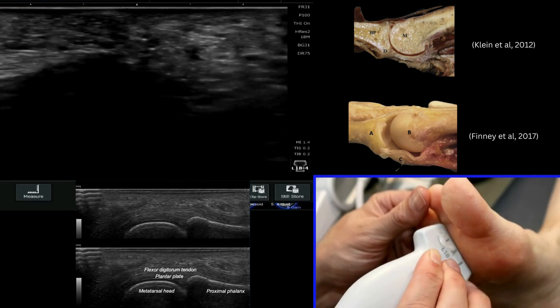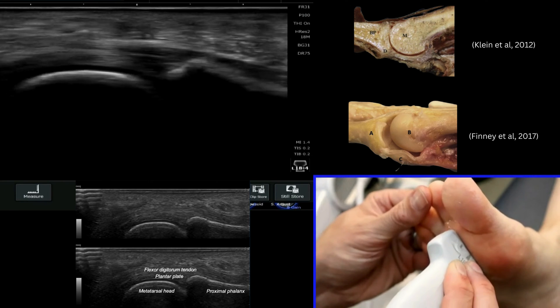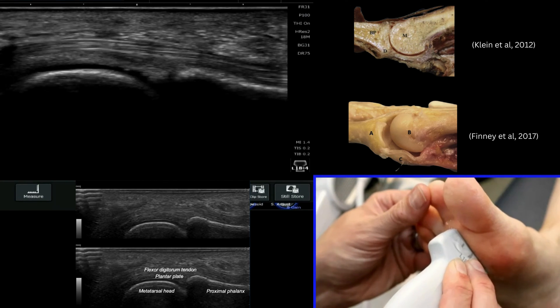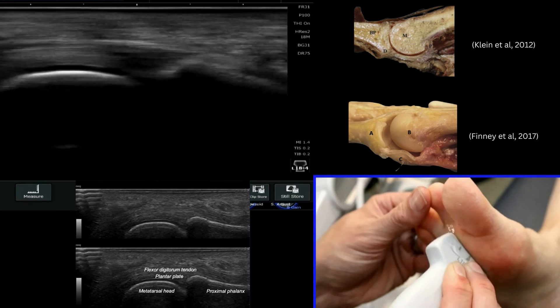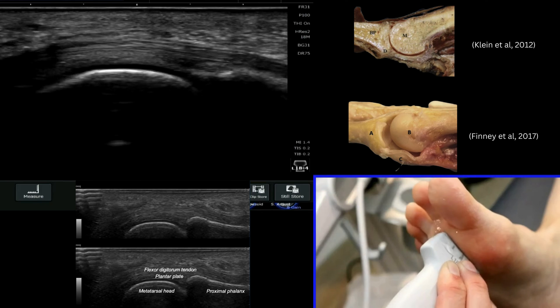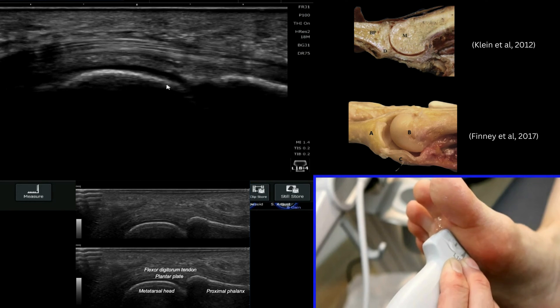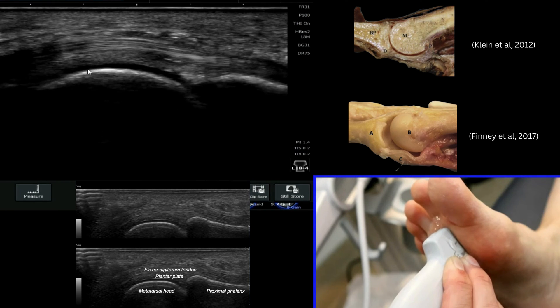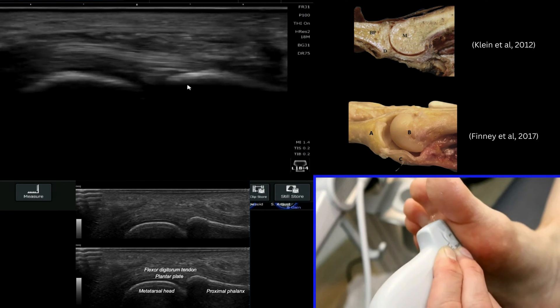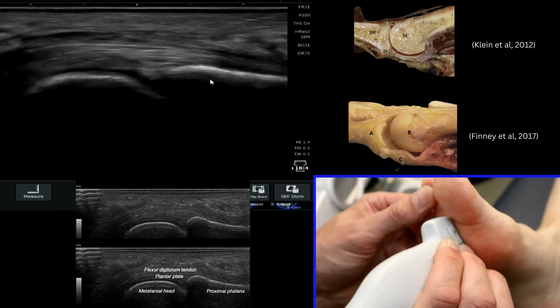Place your probe in a long axis view. The first thing to do is to have a look and ensure that you understand what is proximal and what is distal in your image. You can work that out partly from the sonographic appearances of the metatarsal. The distal part of the metatarsal has that articular cartilage — that black line on top — and we then know that this is the phalanx on this side.